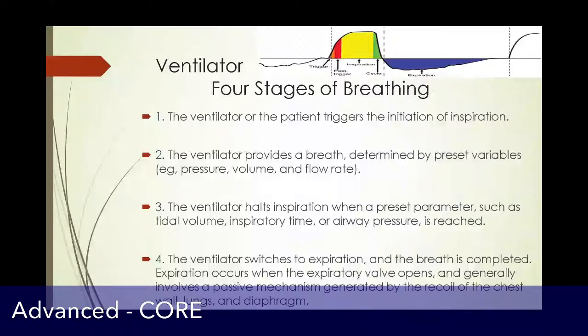Depending on how it's set up, either the ventilator will have a trigger or the patient themselves, as in a normal setting, will take a breath and start the process of delivering a breath. Secondly, the ventilator will deliver that breath after it's triggered. How much, and what the composition of the gas is, will depend on your ventilator settings.